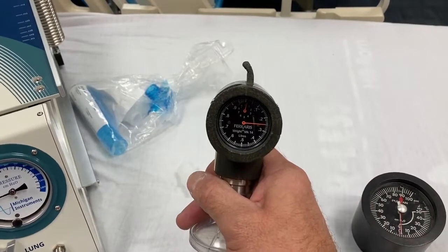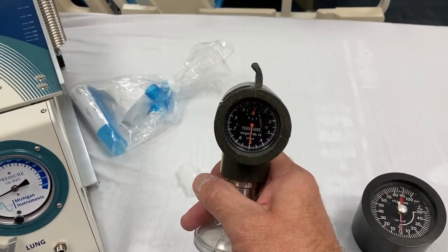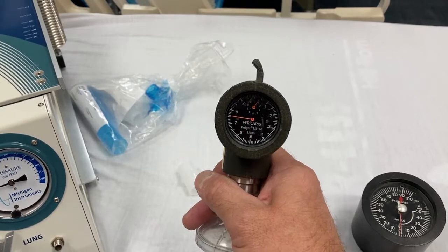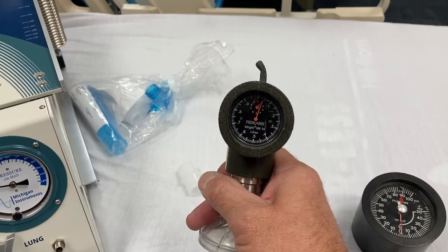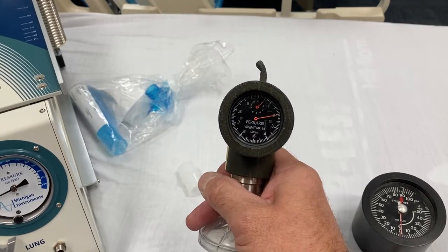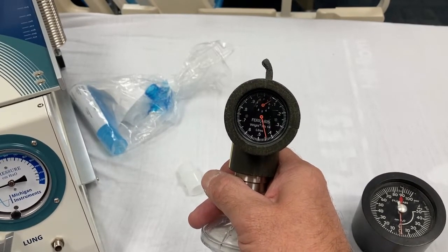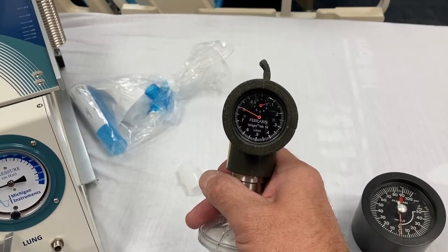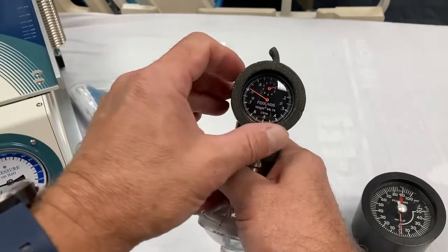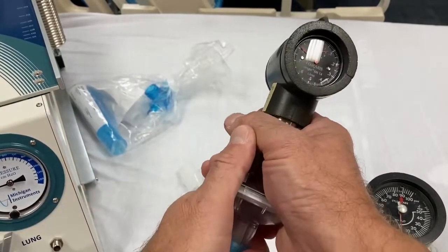Okay, so as this is running, you can see their respirations. And so what you're going to do is you're going to watch that clock for a minute, and you're going to count every time that needle moves. And once you get to the minute, then you're going to either click it off or disconnect it right away.